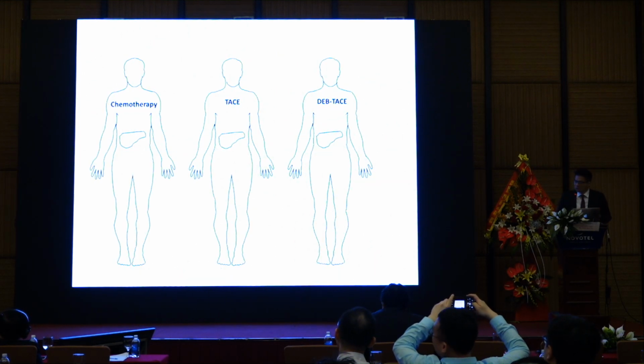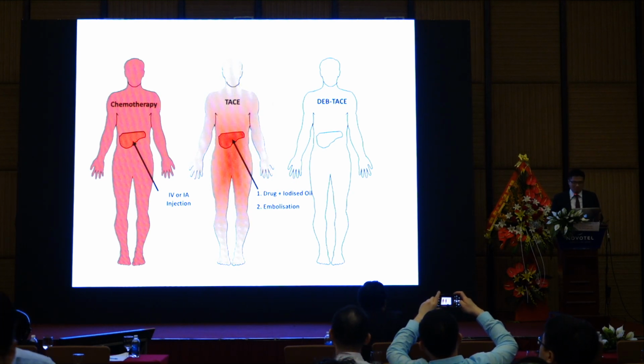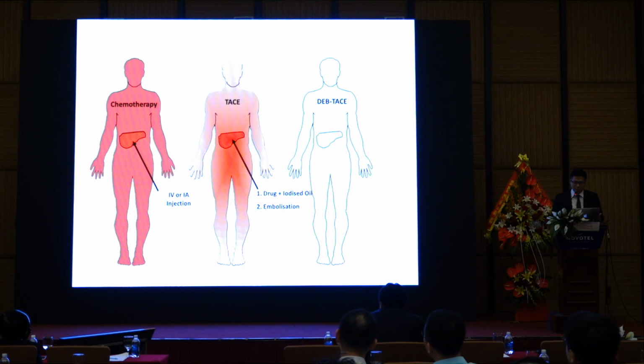As we know, conventional TACE is one of the standard HCC treatments, especially for intermediate stage HCC.